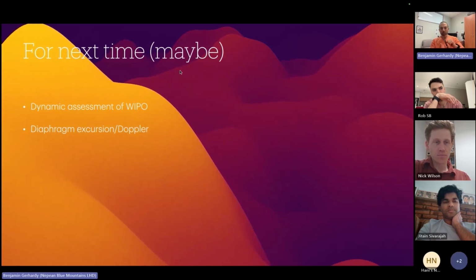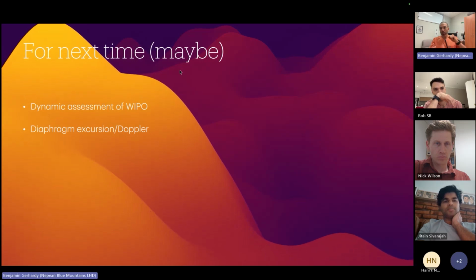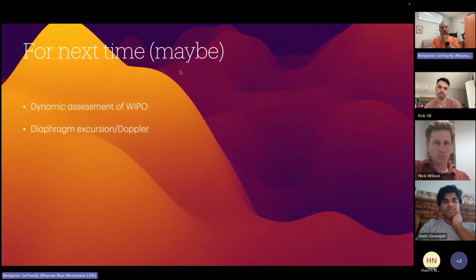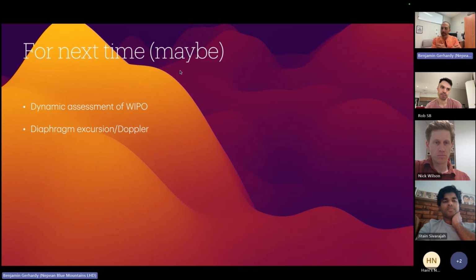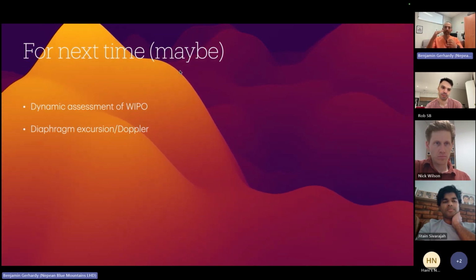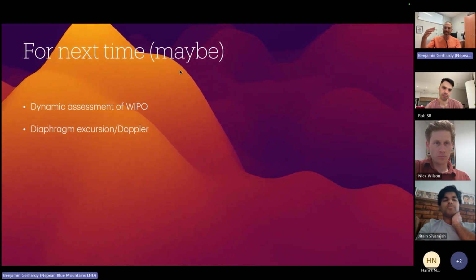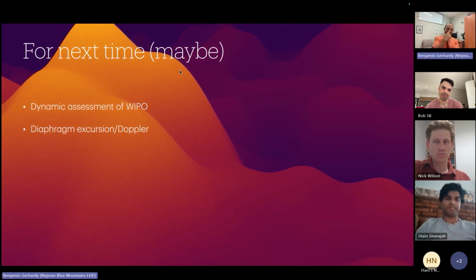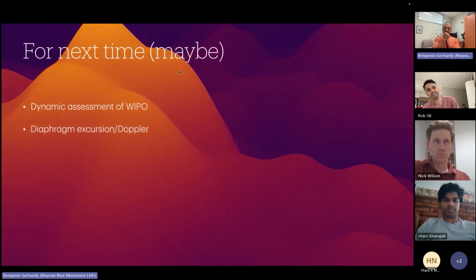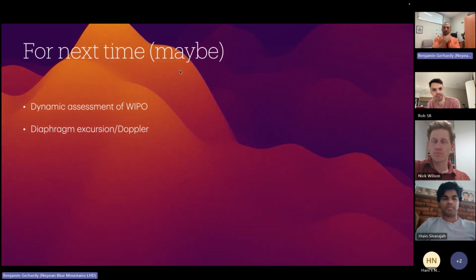It's nice when you've got a huge effusion and the diaphragm's everted, so it's gone the wrong way. You can see all that sort of stuff. It looks cool. But in terms of gauging it for examination, no, I wouldn't expect that at all. And if it was there, it'd be one of the things to differentiate the good candidates from whoever is going to get the award for topping it out. And if not, then we call it.